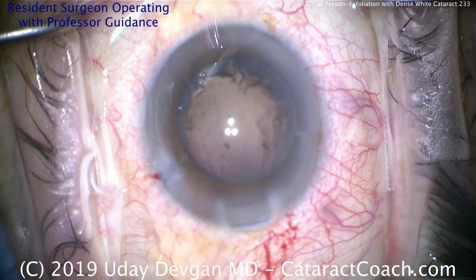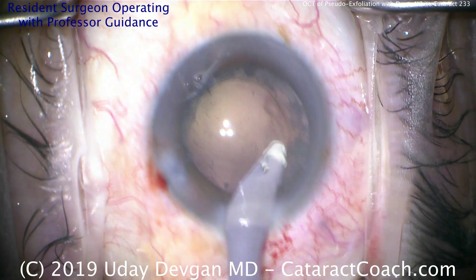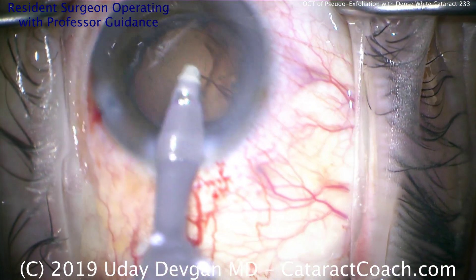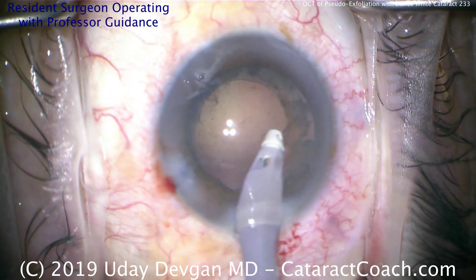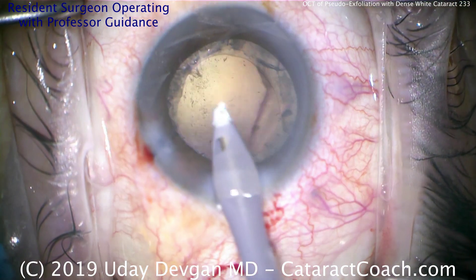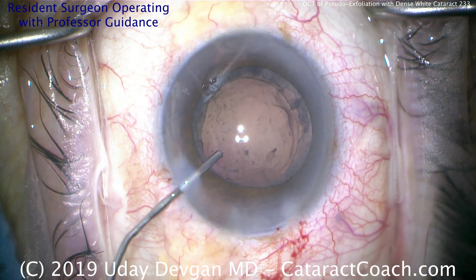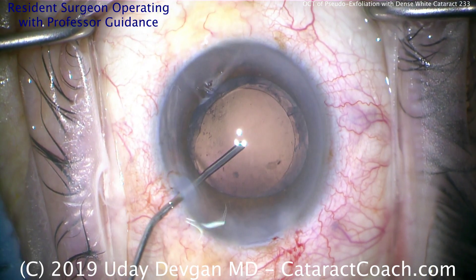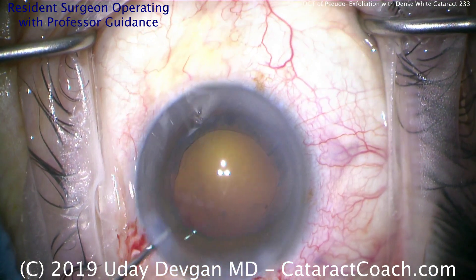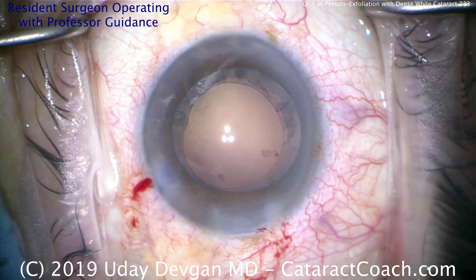Wow — what a huge difference for this patient. A little bit of cortex removal. During the cortex removal, look at the edge of the rhexis — very important. If the rhexis edge is moving, that means the zonules are really weak and they're being broken or are not supportive enough. So do not pull hard on the capsule; you do not want to damage the zonules more. Here it's a pretty good removal of the cortex, maybe a tiny bit remaining. I like the idea of filling the eye with cohesive viscoelastic.